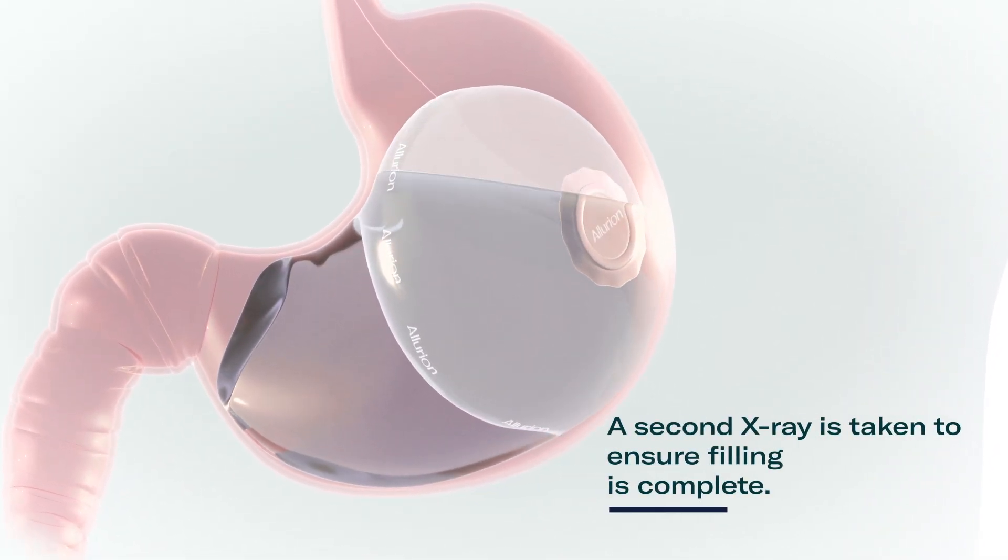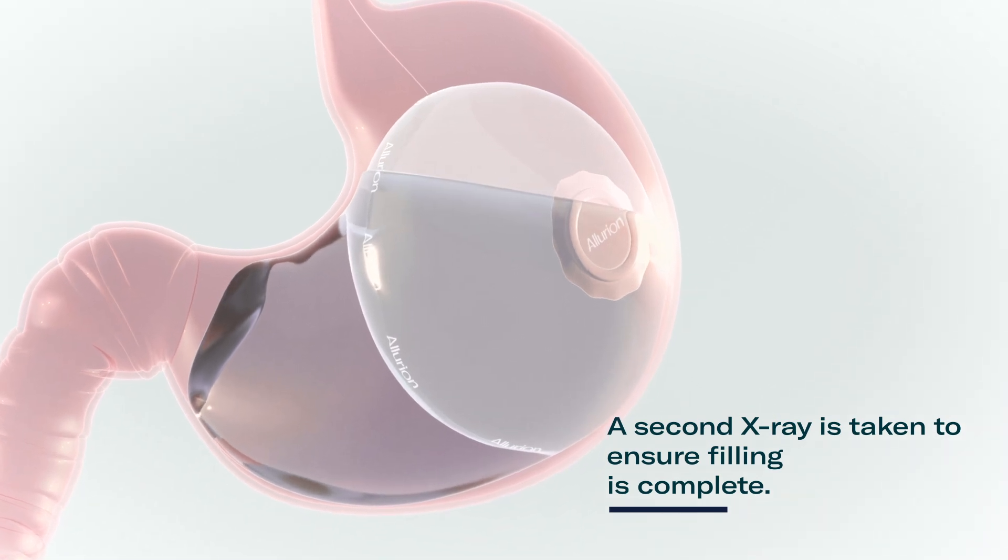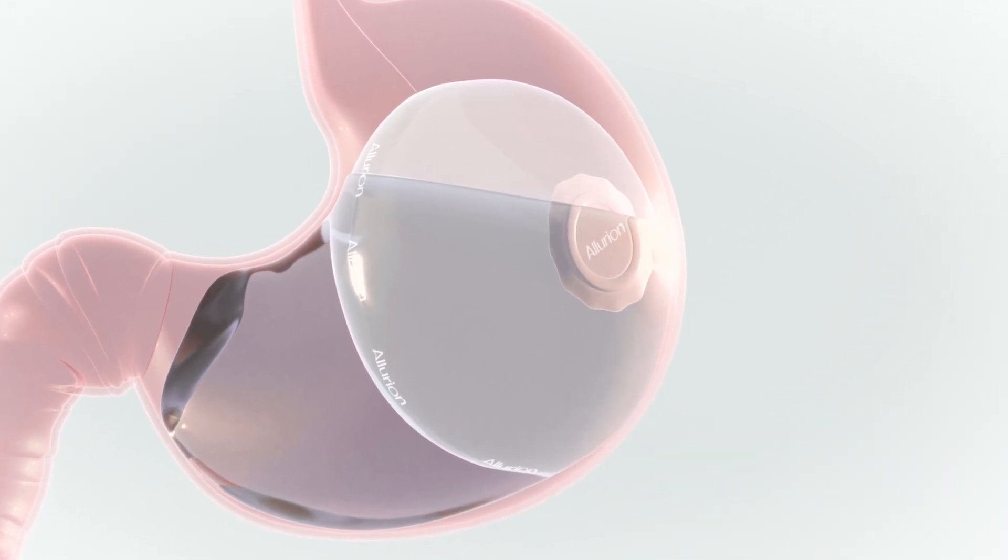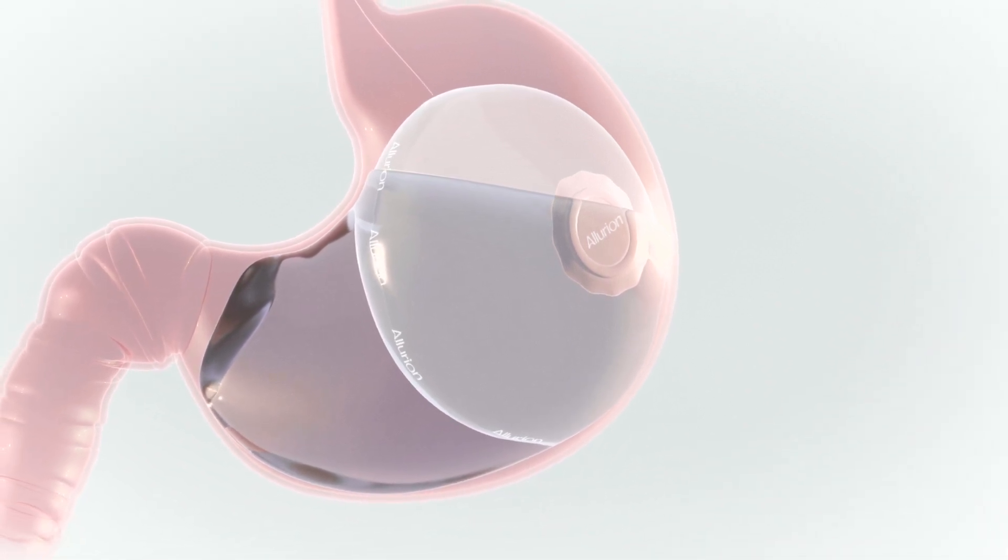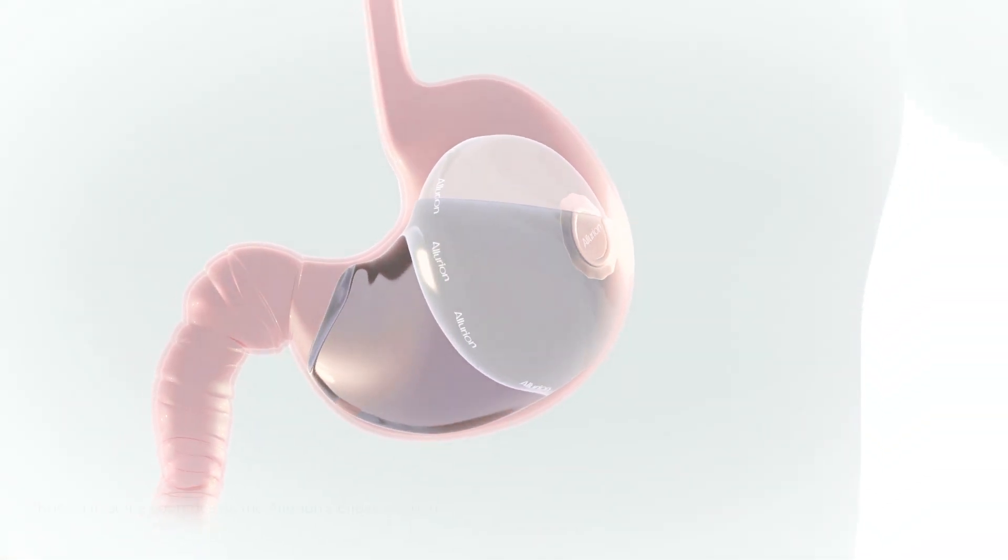Then, a second x-ray is taken to ensure filling is complete. The full balloon is roughly the size of a grapefruit. Your healthcare professional will gently remove the catheter from your mouth. The Allurion balloon placement has now finished.